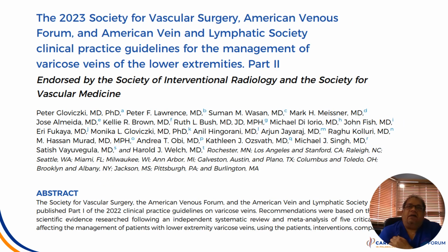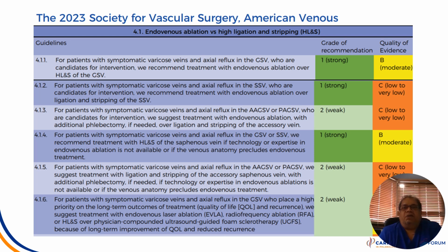Let's look at the guidelines. If we did this from the start, there would be no need for this presentation. The guidelines clearly state that endovenous ablation is the way to go when treating venous disease. There are a few caveats to this, and I do suggest that you read the 2023 guidelines.